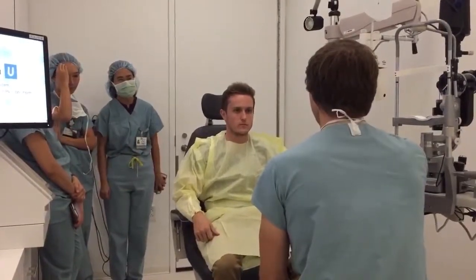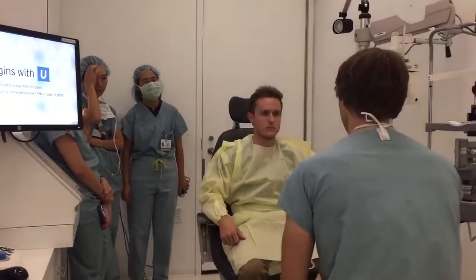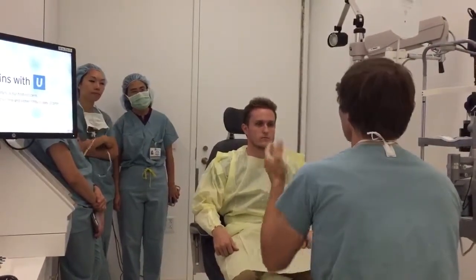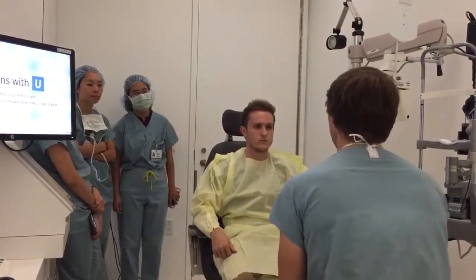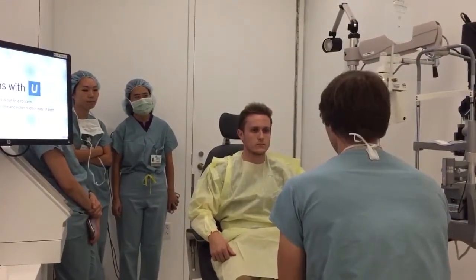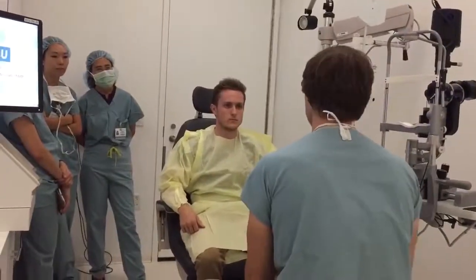We're going to tape the eye shut that we're not working on, so you don't have to try to keep it closed. We use an eyelid opener, so you don't have to worry about blinking. Plenty of numbing drops, so you're not going to feel like you have to blink. There's a green flashing light as your target to look at — that's all you need to be concerned with.